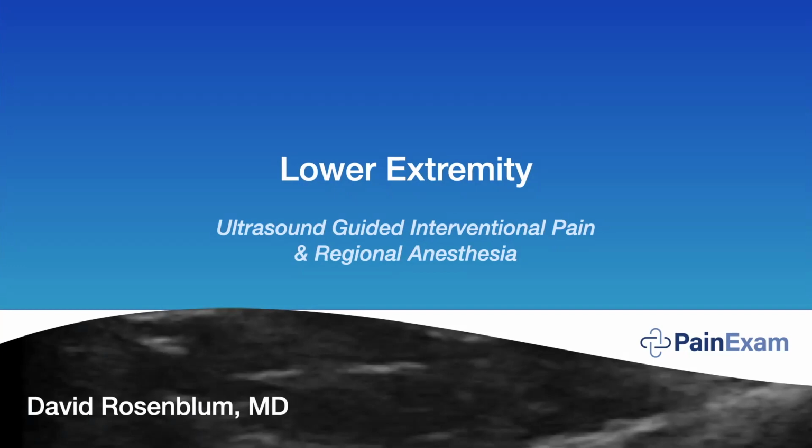I'm actually going to answer a question first about frozen shoulder. We have a question asking how much local anesthetic and steroid I use. Do I ever use PRP, alpha 2 macroglobulin, for this block under ultrasound guidance? Okay, so I actually went over some of this in an ASIPP talk I just did last month on regenerative medicine for the upper extremity.